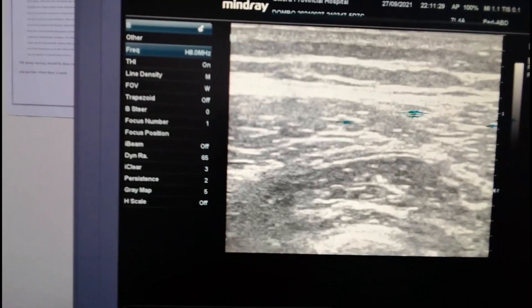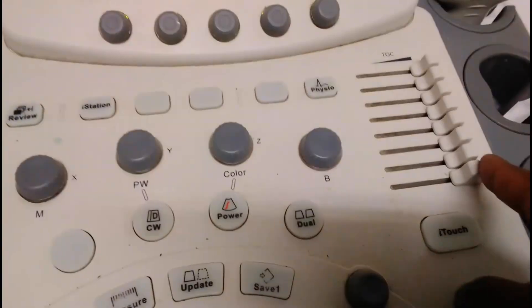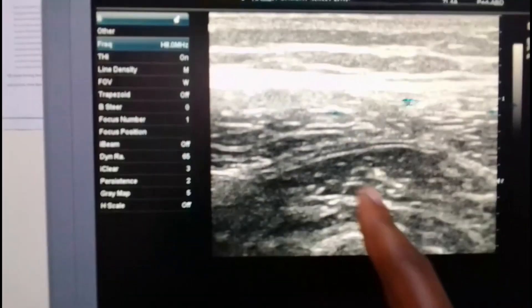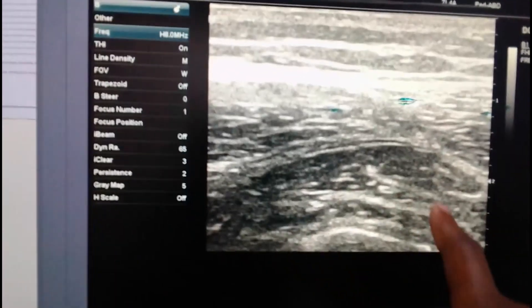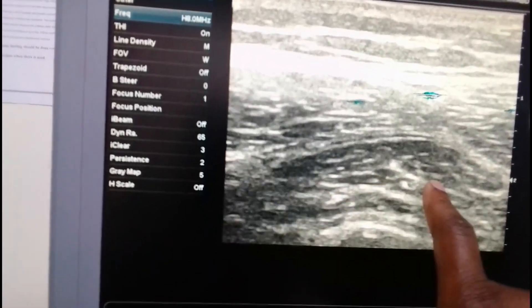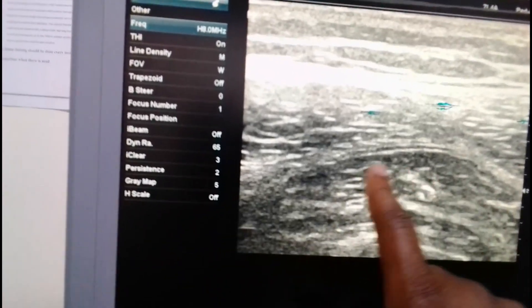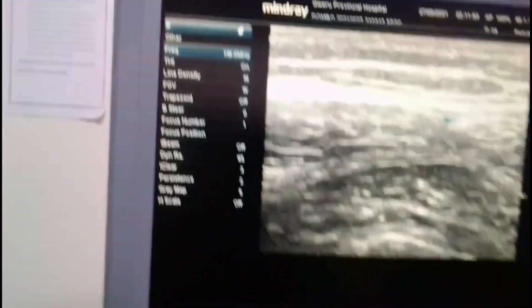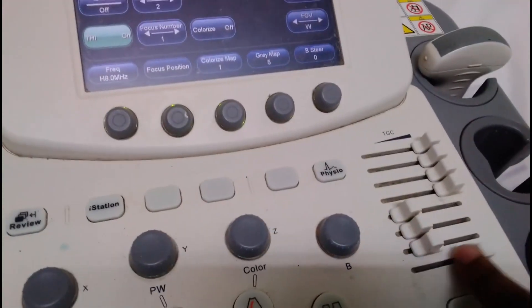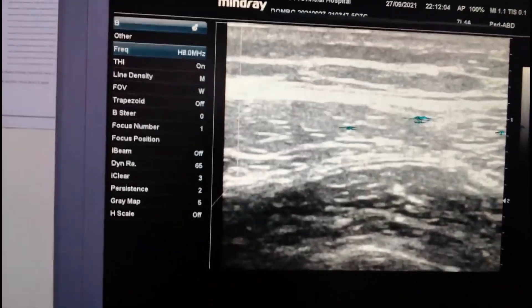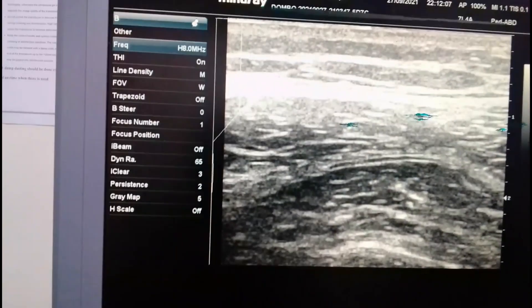They are now straight and see how the image looks. I am pushing these lower keys here, and you can see below it has just become more hypoechoic. So there is a muscle here which is different from what you have in the rest of the image. But if I take back these keys, you can appreciate that it is somehow gone. As I move them again, you can see it is becoming dark.